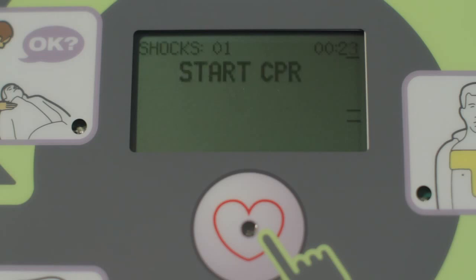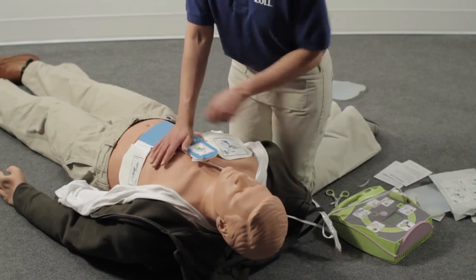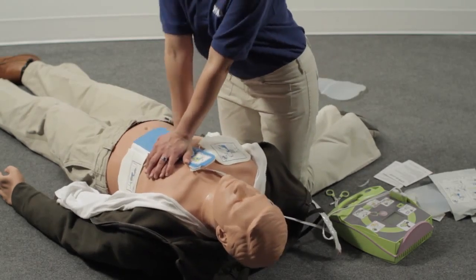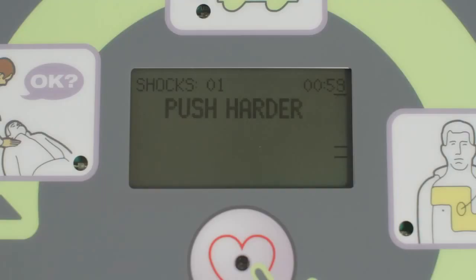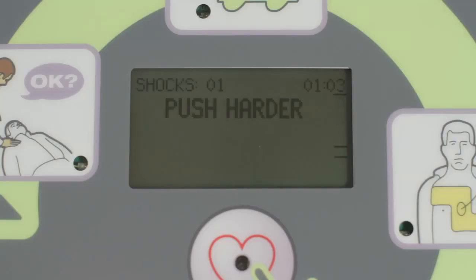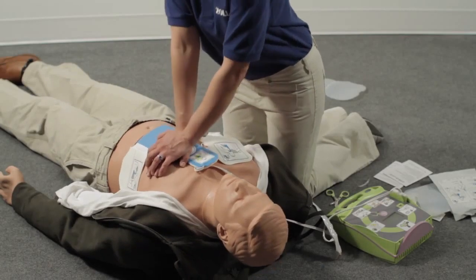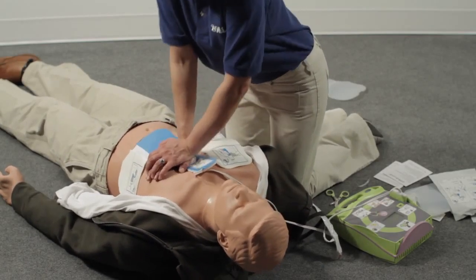After the shock, immediately start CPR. Do your compressions by pushing down on the CPR landmark. If your compressions aren't at least 2 inches deep, the AED Plus will let you know. The AED will let you know every 15 seconds if you don't reach the target CPR depth. After being told to push harder, if your compressions reach at least 2 inches again, the AED Plus will let you know.